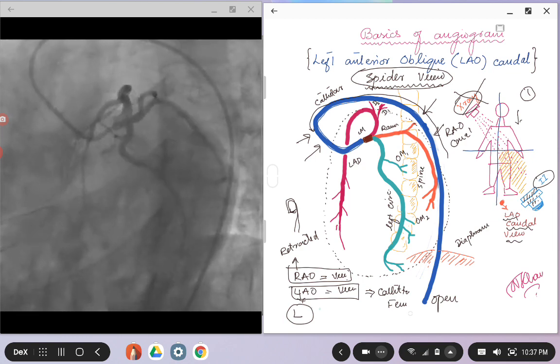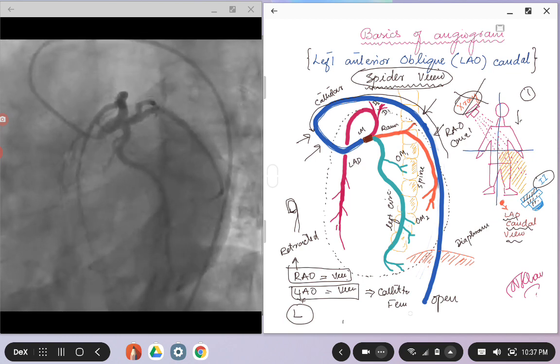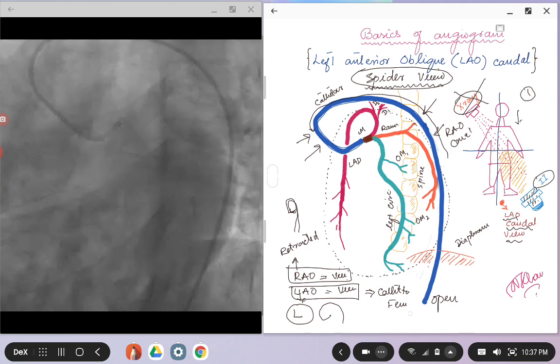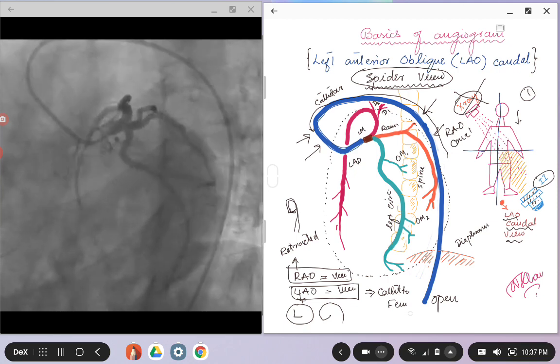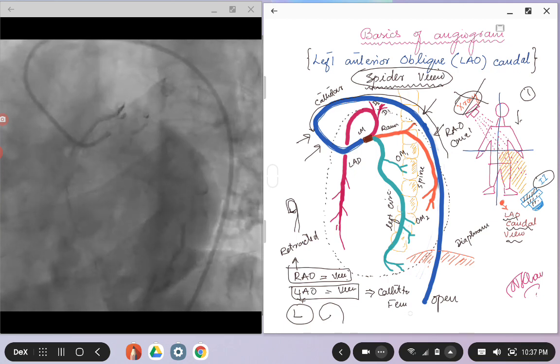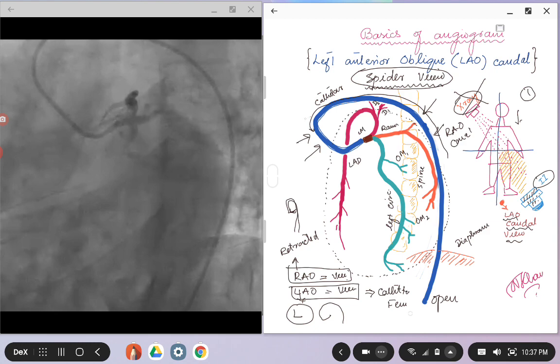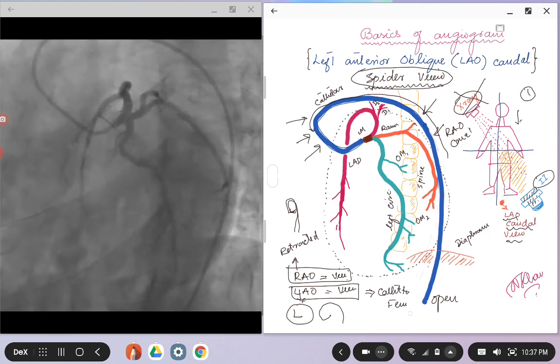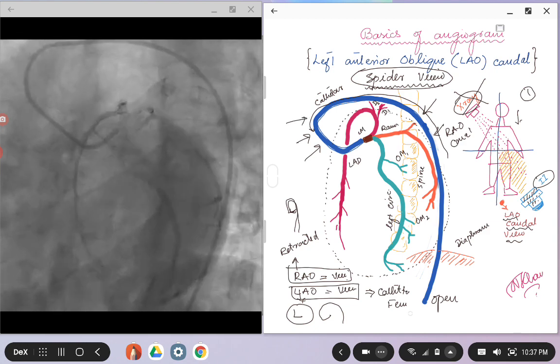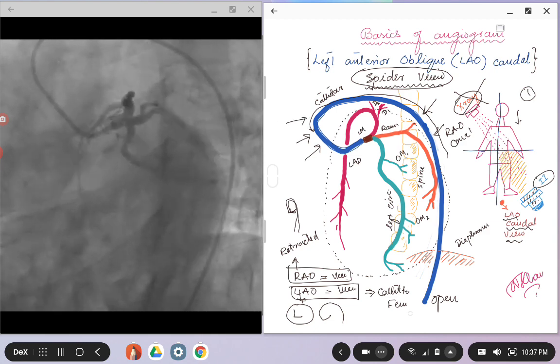So whereas in the LAO views, the catheters will be opened up. So if you see an image where you see the catheter which is nicely opened up like in this picture, it's most probably an LAO view.